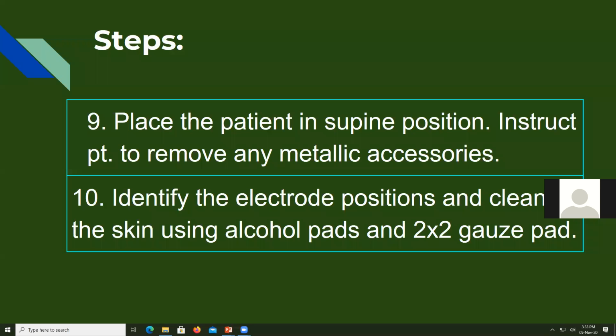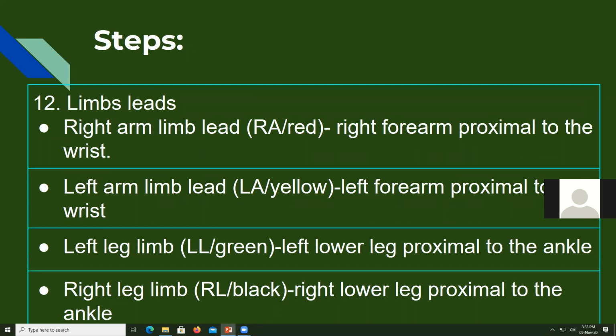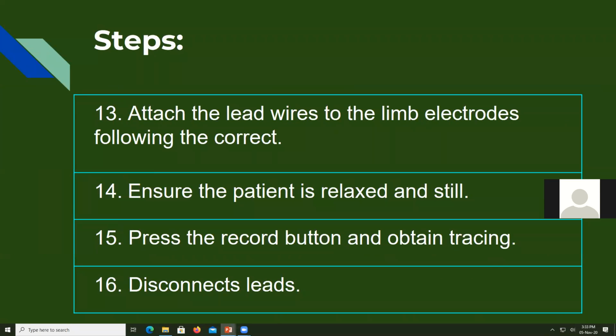Identify the electrode position and clean the skin using alcohol pads and 2x2 gauze pad. Then, of course, I already discussed this one, the placement. And then attach the lead wires to the limb electrodes following the correct arrangement or correct sequence. And then ensure the patient is relaxed and still. Press the record button and obtain tracing.